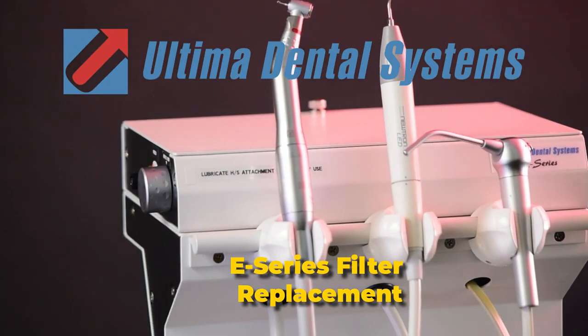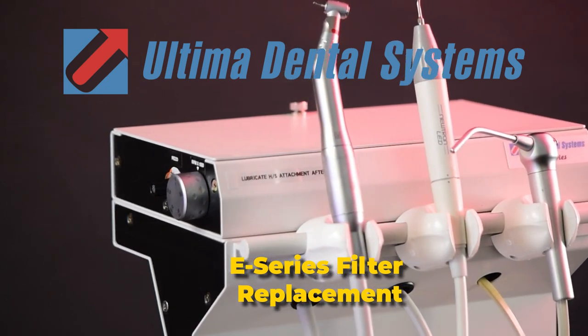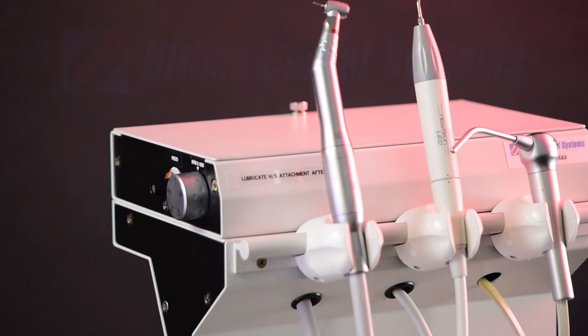Oil-less piston compressors are easy to operate and virtually maintenance-free. However, regular upkeep is essential for optimal performance.